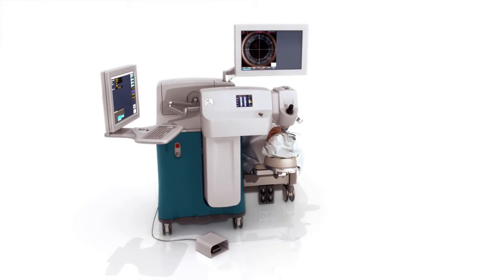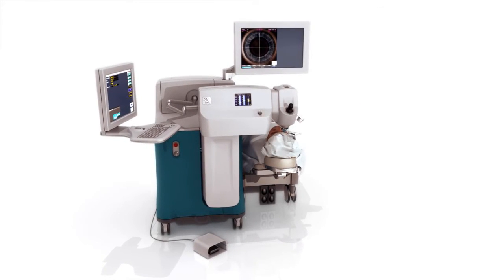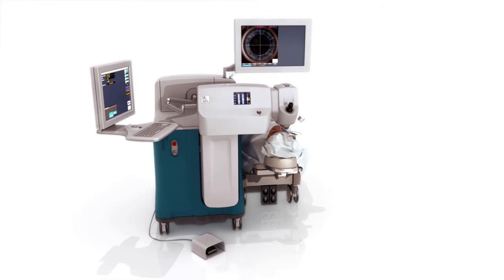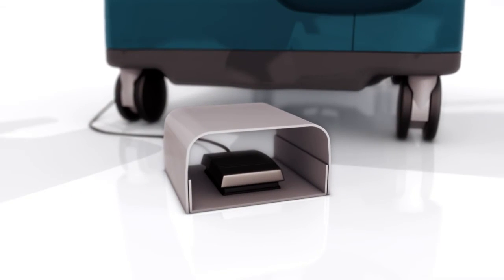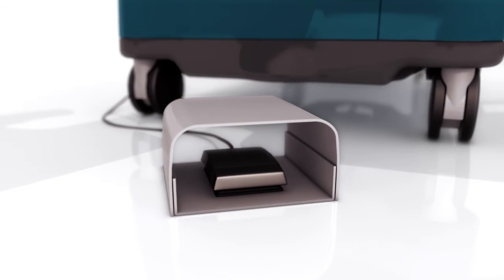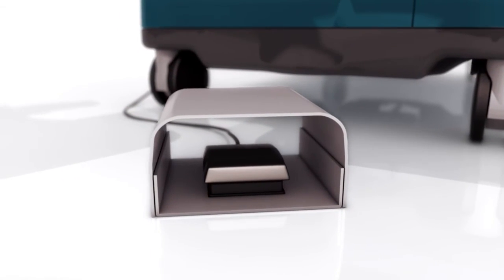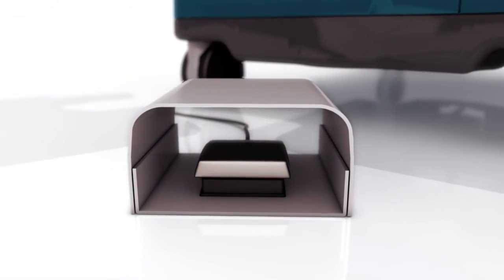After each cut to be performed has been programmed into the system, the LensX laser foot pedal is depressed and the procedure begins.